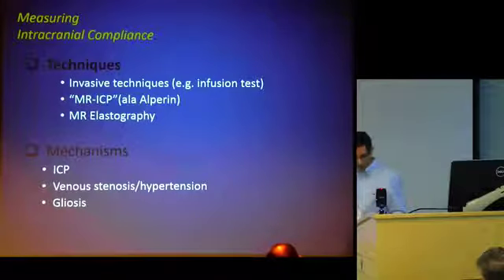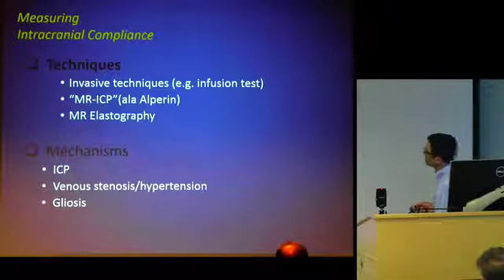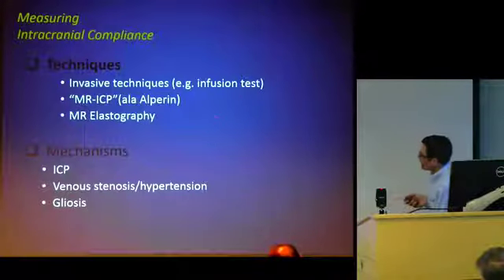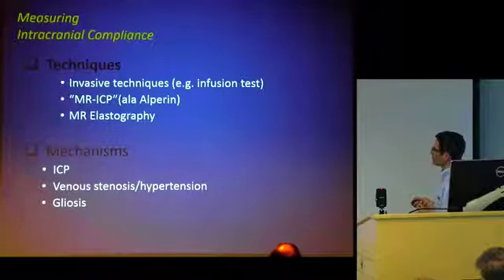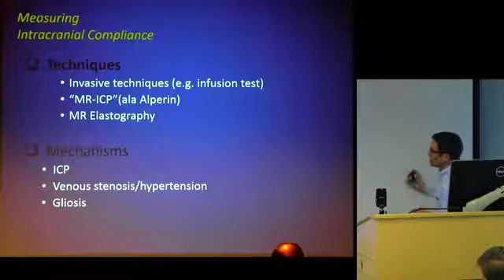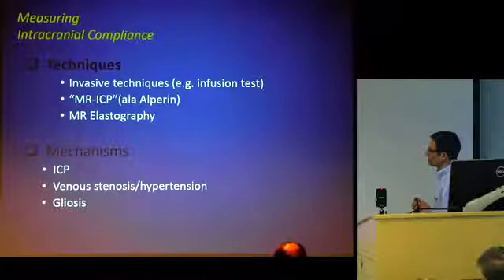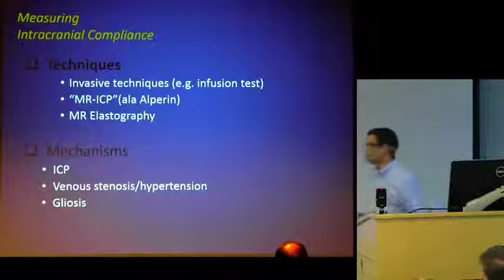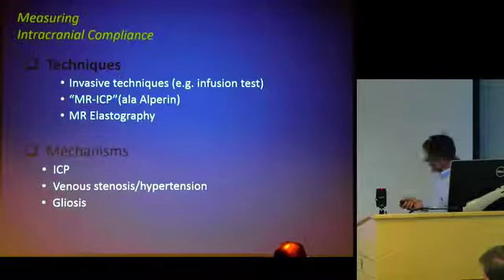So how do we measure compliance? There are obviously invasive techniques with the infusion tests. Someone mentioned Alperin, his MRICP test, which I really think of as an MRICC test. The jump from compliance to pressure is a leap of faith, but at least for measuring compliance, I think it's an interesting technique.